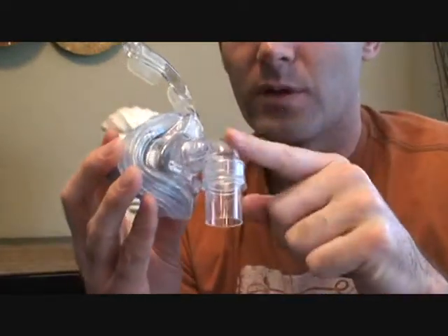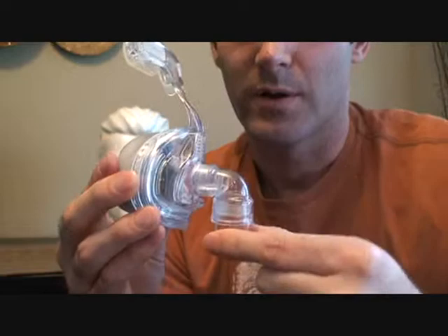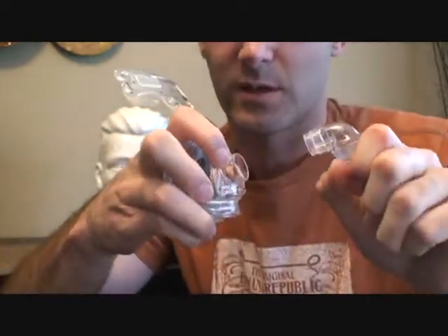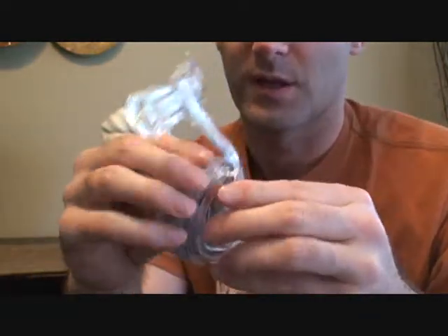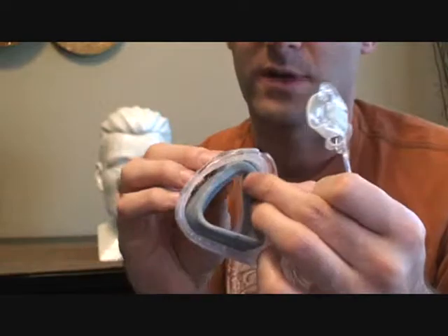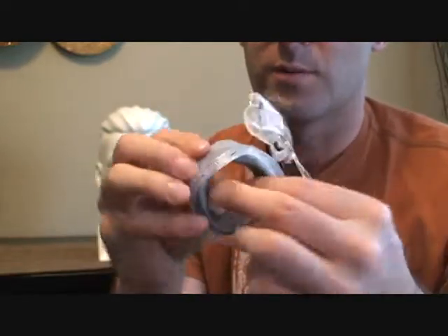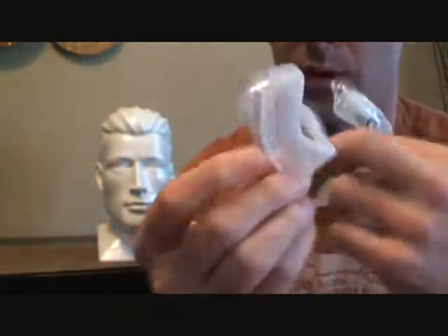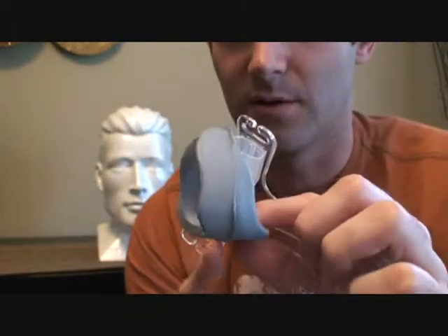If you wanted to pull this nozzle off, I tell people to grab here and pull this way while you're holding this firm. And then this entire thing comes off. And this nasal piece, just pull the entire piece off. And there's like a hard plastic rim here that comes off with it. So you have the outer membrane with the hard plastic and the inner cushion part.